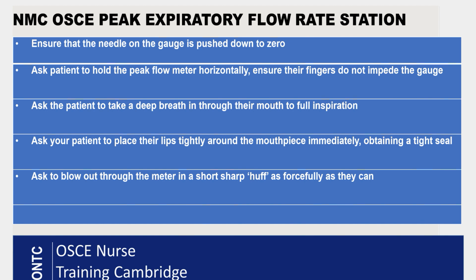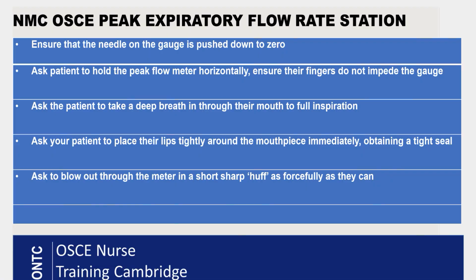And then the next thing will be, ask your patient to take a deep breath in through the mouth to full inspiration. So deep breath in through the mouth to full inspiration, and then ask the patient to place their lips tightly around the mouthpiece, immediately obtaining a tight seal.